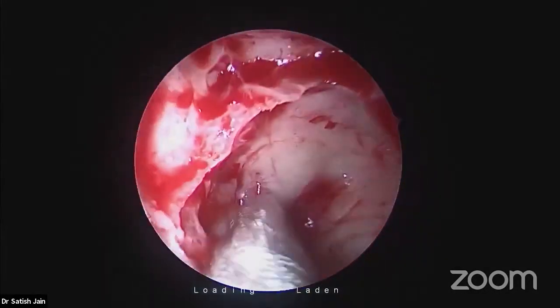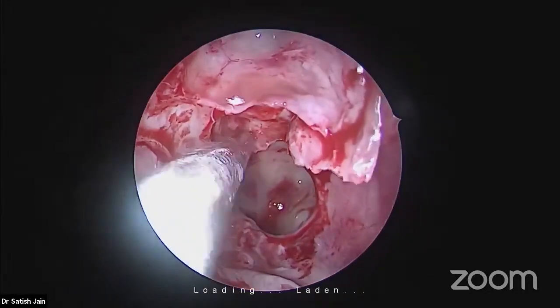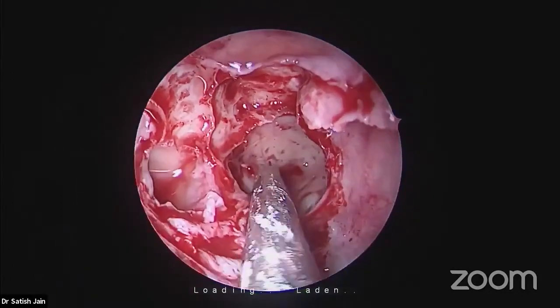This is my carotid prominence. Can you see this? Yes. See this bluish? And this is going to be the optic nerve prominence. Here. From here to here, this is carotid.